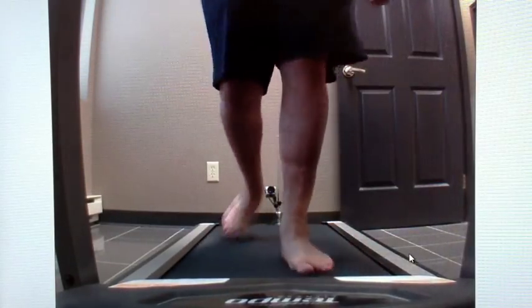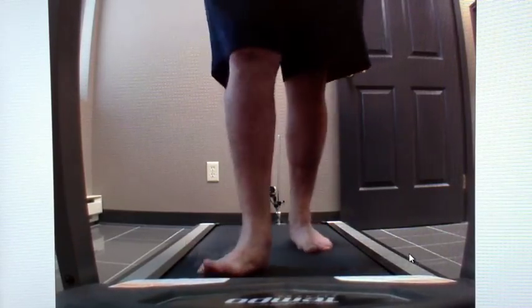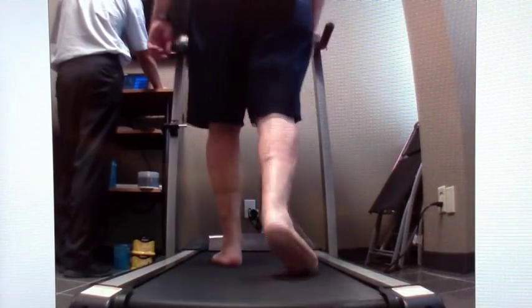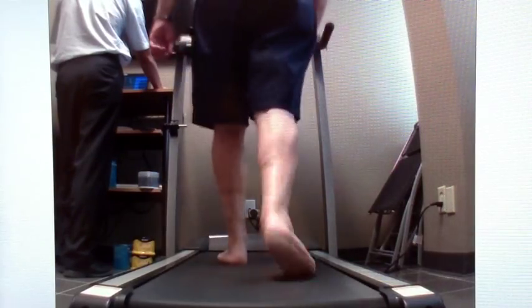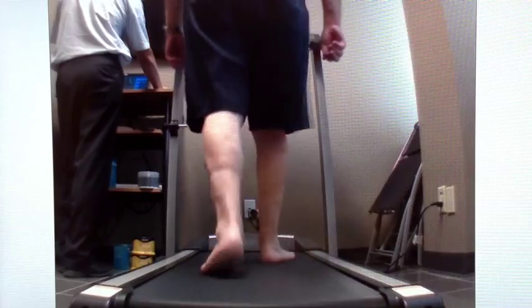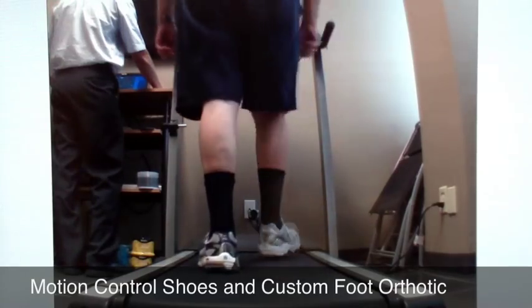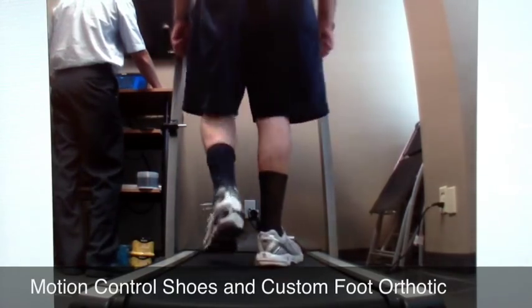The Pedigate system also allows us to see what effect our treatment is having. Take for example this patient who came to the office with a painful posterior tibial tendon dysfunction in his right leg, caused by a severe right flat or pronated foot, as is seen in both the front and rear cameras from this video. We are able to see the improvement in function on the right side with a custom foot orthotic and proper motion control shoes.